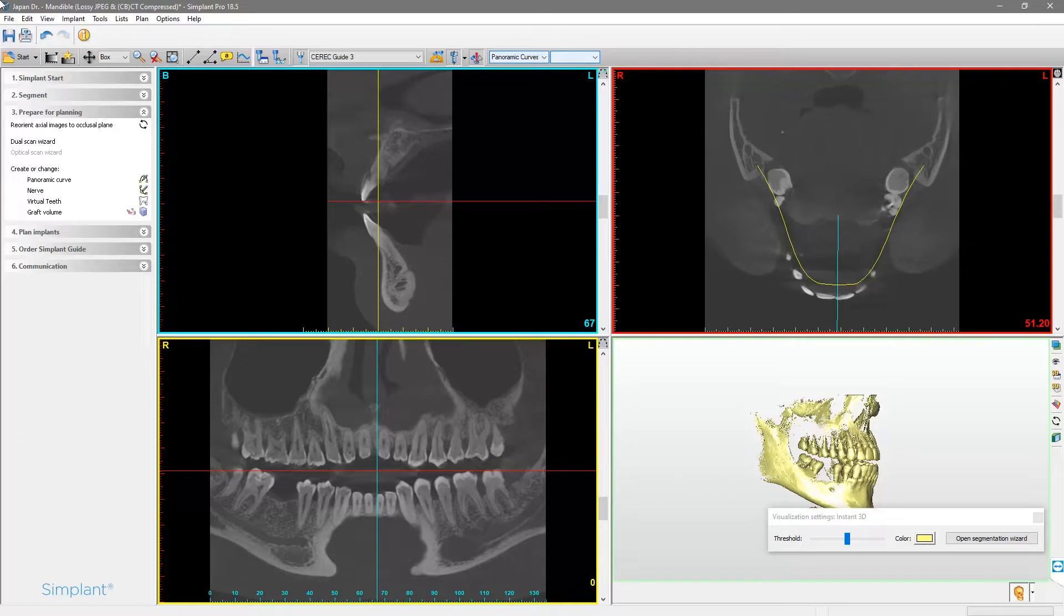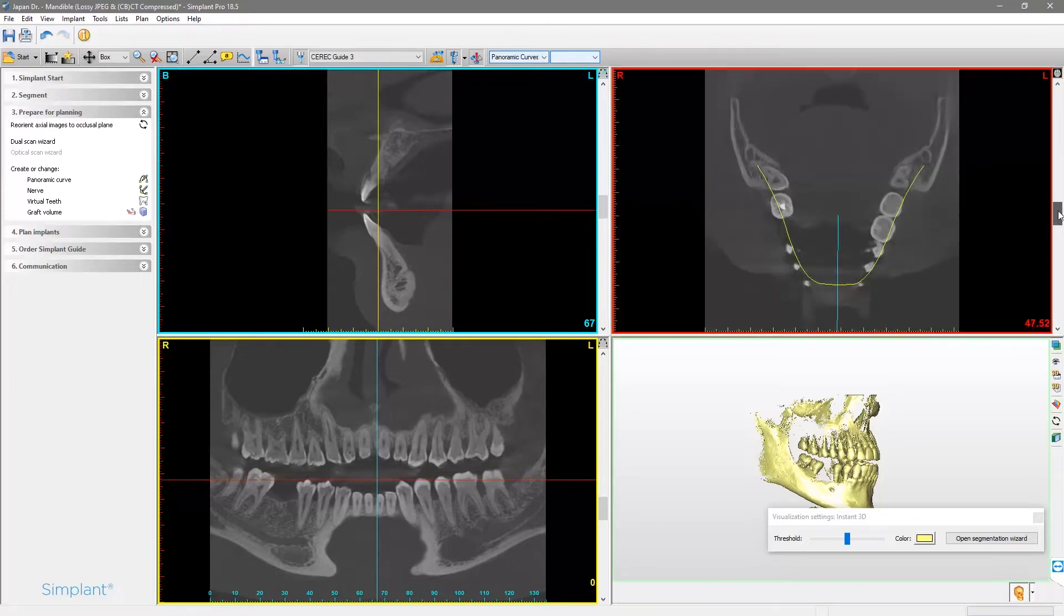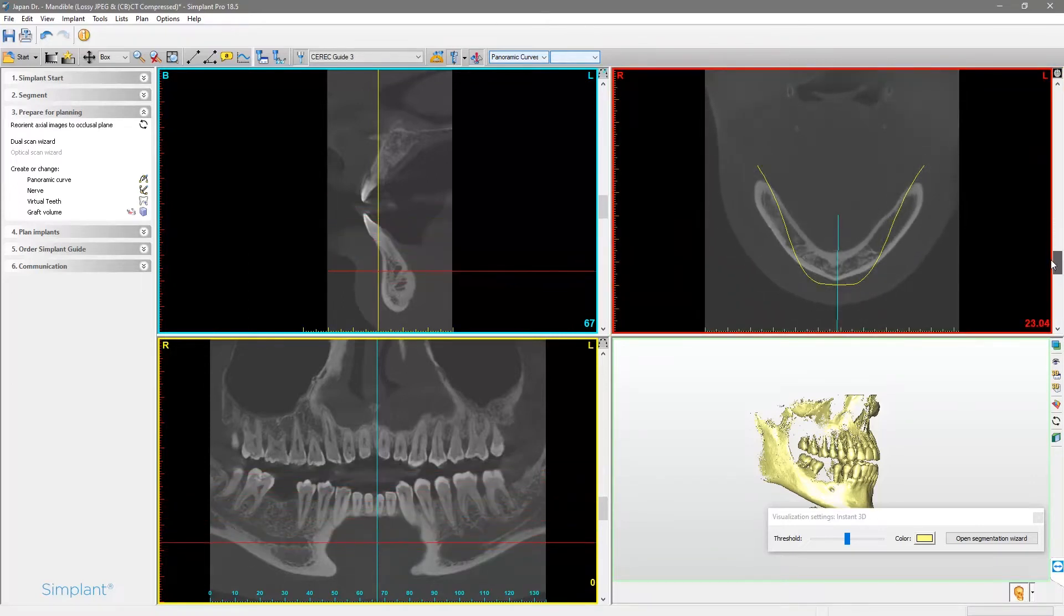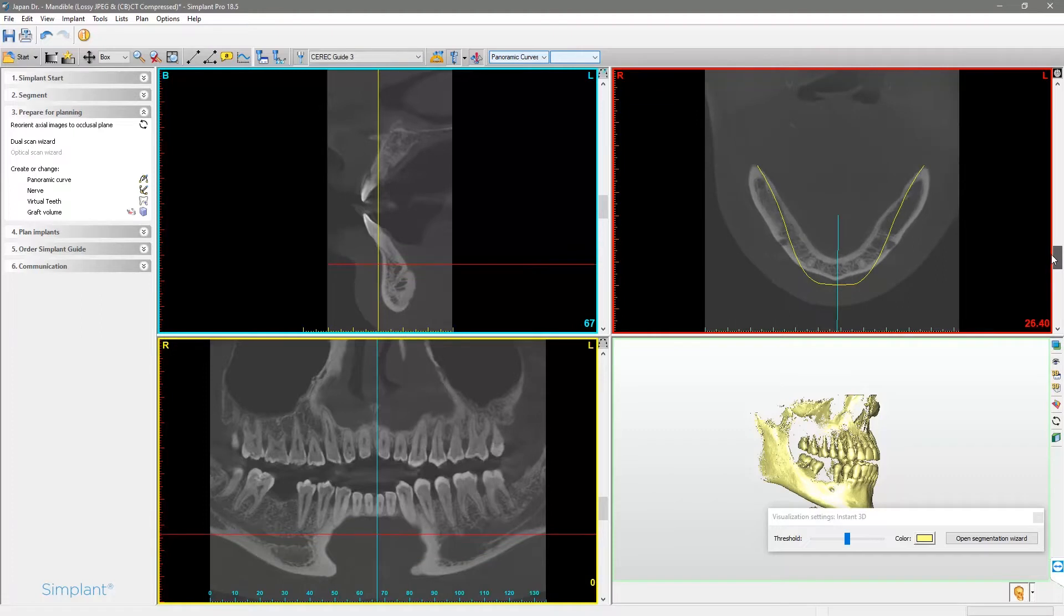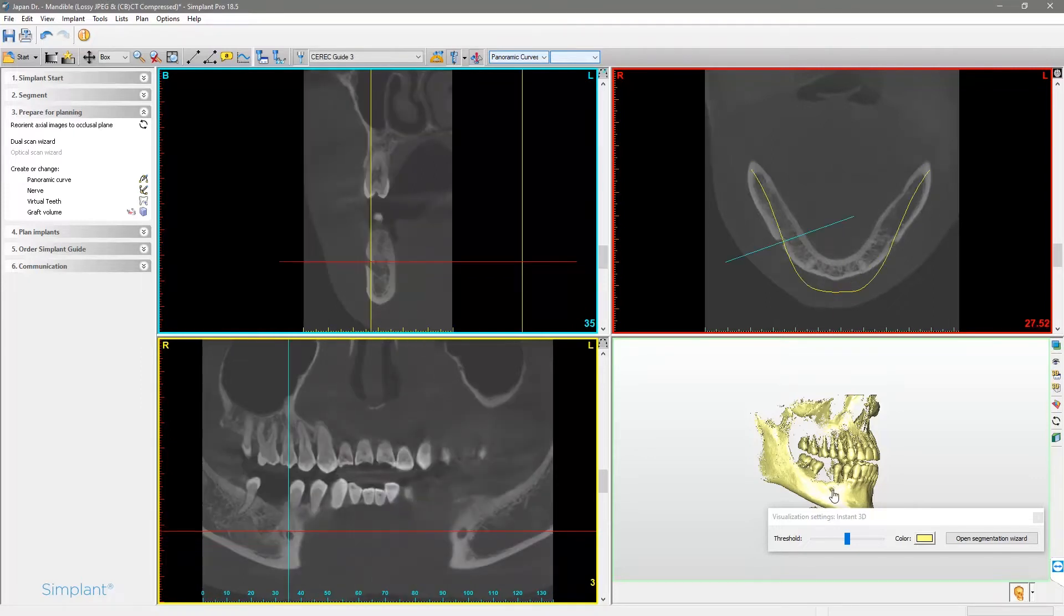First, we scroll through the image in the axial view and familiarize ourselves with the anatomy to identify the nerve's path. In the 3D view window, we left-click on the foramen mandibulae in order to move the correct slice in the 2D view window. We click Nerve to start drawing the nerve.